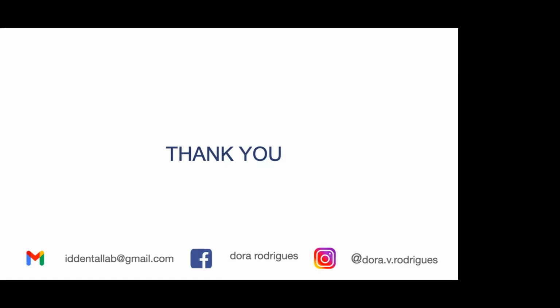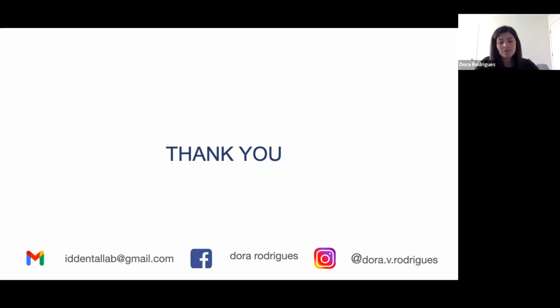That's great. Dora, when you decided to start printing, was it the actual printer or was it the material that you started to research first? It was the material, and that is something that I say often. Every printer can print, right? It's a type of equipment that you can use, but you need to look at the resins. If you're printing models, any printer will do, right? But if you are printing dentures, for these specific cases, you need to pick the right material with the right conditions, the right properties.